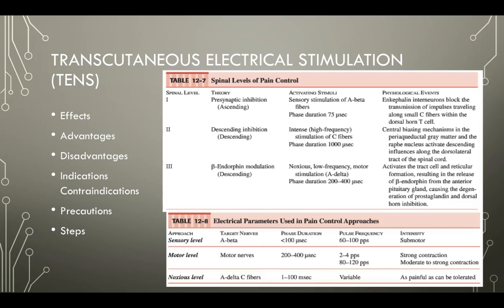Then we prepare the equipment. So we turn it on, and then we're going to set our settings, and we'll talk about those individually. But that's going to be our duration, so our pulse duration or phase duration, as well as our pulse frequency or our pulse rate.